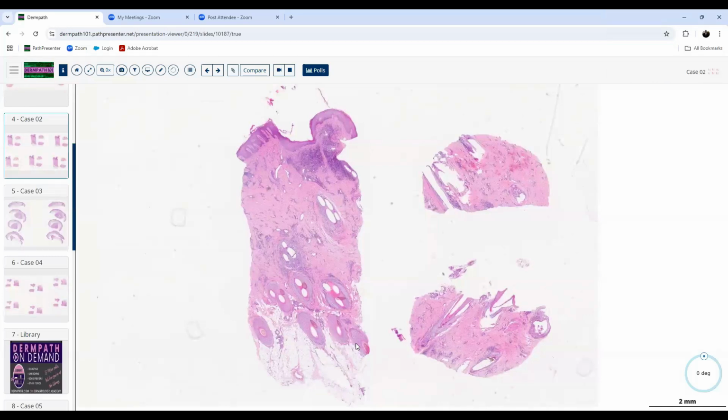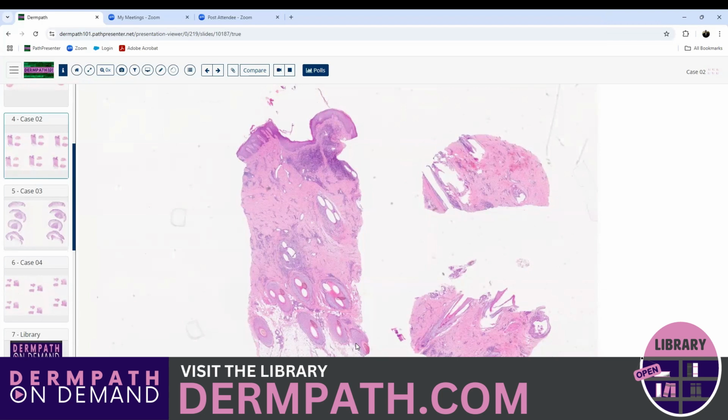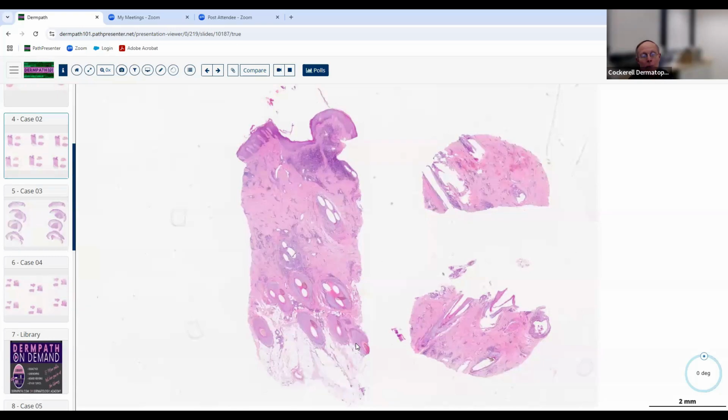Now, there are some things in dermatopathology that lend themselves to a very simple, almost mathematical approach to applying criteria. Alopecia is one of them. The other one is panniculitis. Sometimes the diseases don't read the textbooks and don't obey the criteria, but you can go down a pathway when you're dealing with things like panniculitis and alopecia. So here we're dealing with an alopecia.